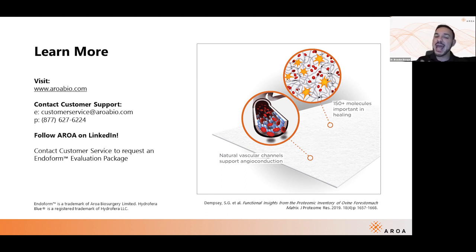I'd be a little bit hesitant to use some of these foam dressings with silver in it, because then you might overload that silver and you might not see the magic of the Endoform Ionic Silver. So again, I've used Mepilex Ag, for example, in the past, and that's a great dressing, but I wouldn't use Ag products in conjunction with the Endoform AM, because they're going to dump in that silver. You're not going to get that nice ionic silver slow release that we're looking for.